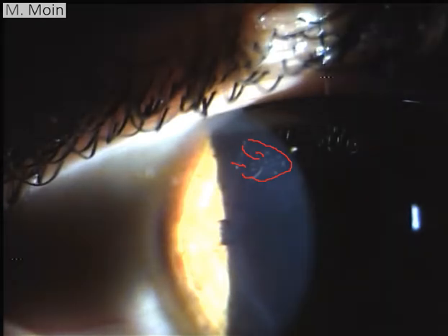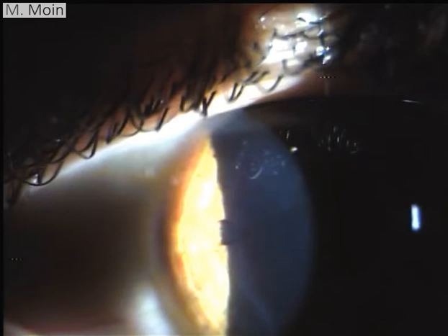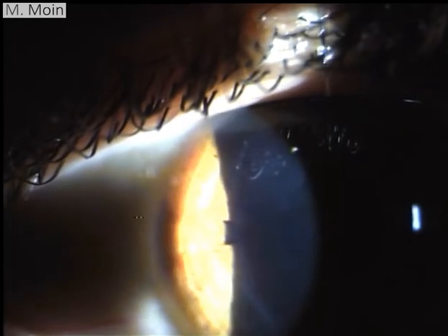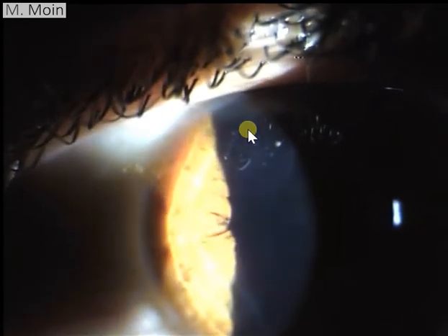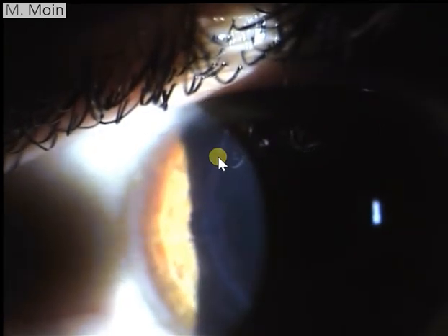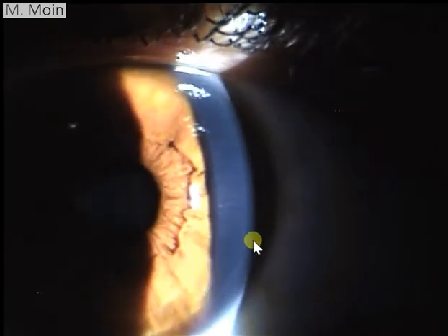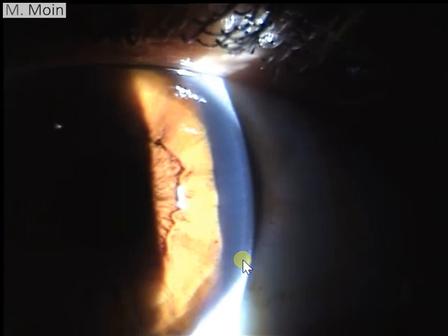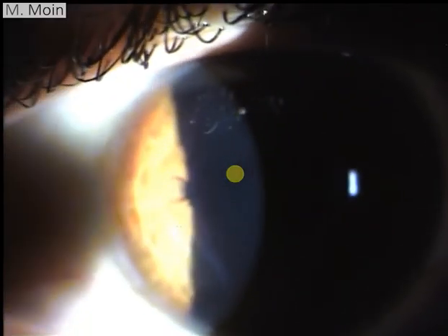Whenever you're looking at a LASIK flap, this flap has been done superiorly - the hinge is superiorly - and you can see the flap going all the way inferiorly and then going this way. The flap is always very visible for the life of the patient with LASIK.